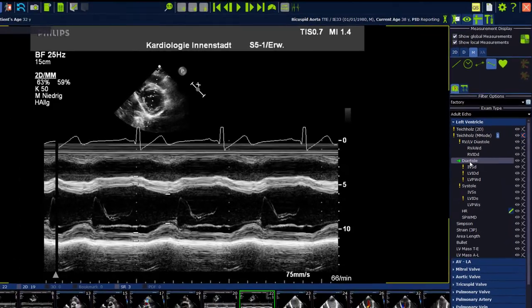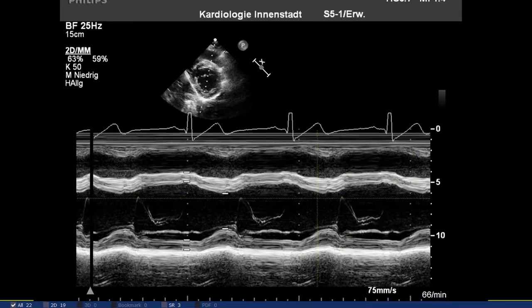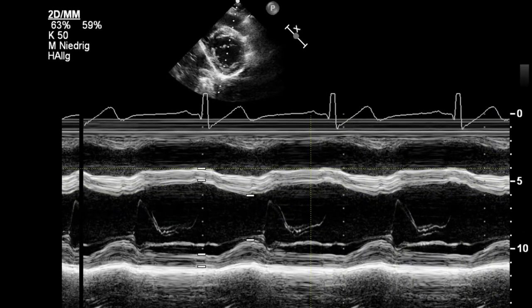Select the diastole and set the first point on the interventricular septum in the right ventricle. Place the other points until you reach the outer border of the posterior wall.